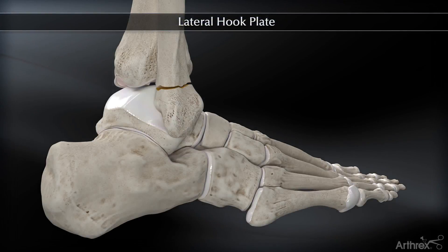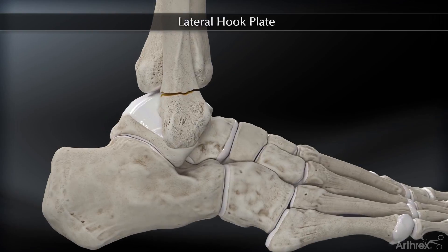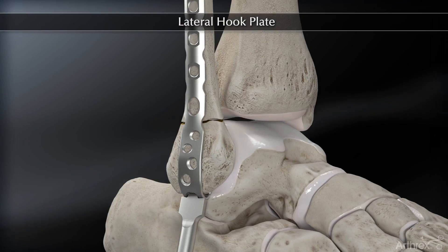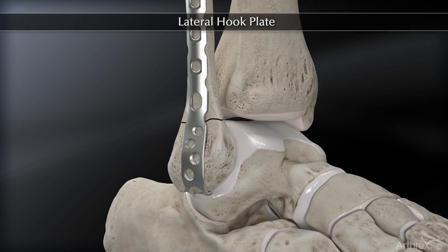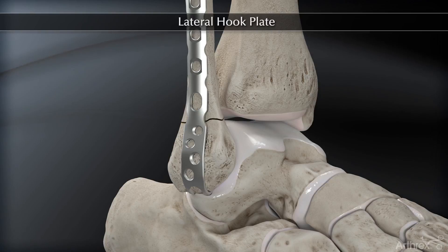I'm going to go over one way of fixing an extreme distal fibular fracture with the lateral hook plate. There are obviously variations to this. In this case, the surgeon is using a bone tamp to tamp the tines into the distal portion of the bone. That is not a necessary step — they're actually intended to go through just the calcaneofibular ligament, but that will be surgeon preference.